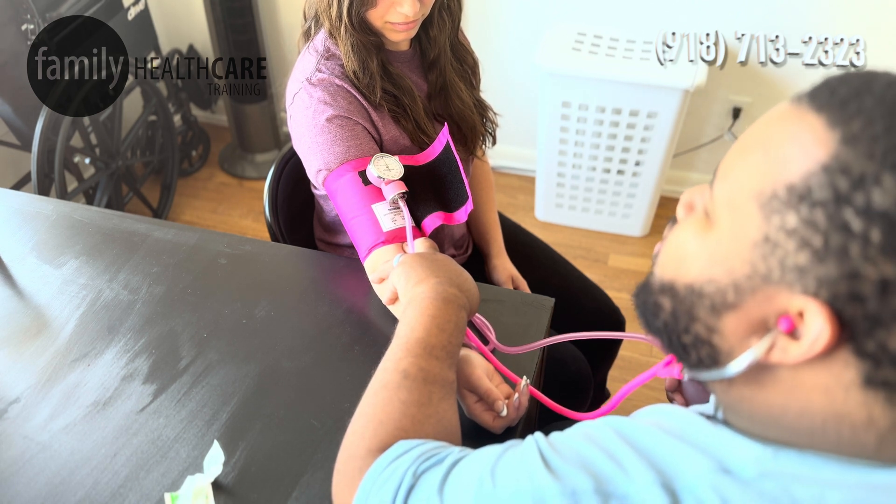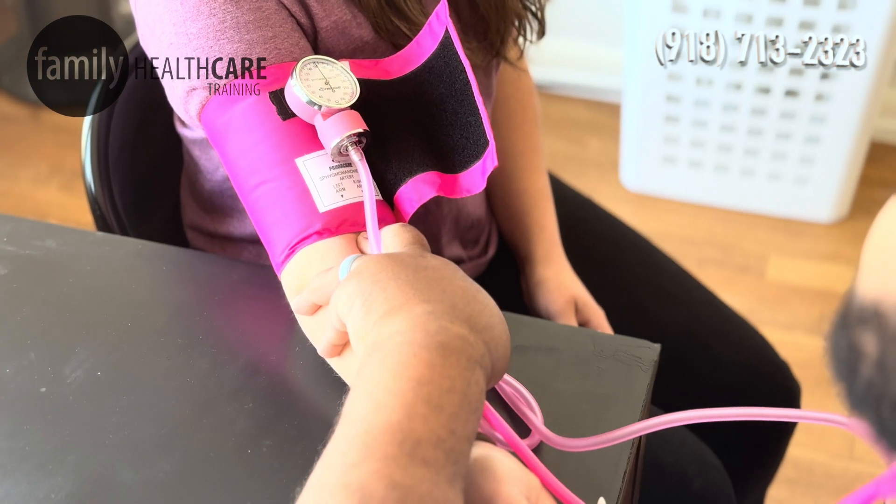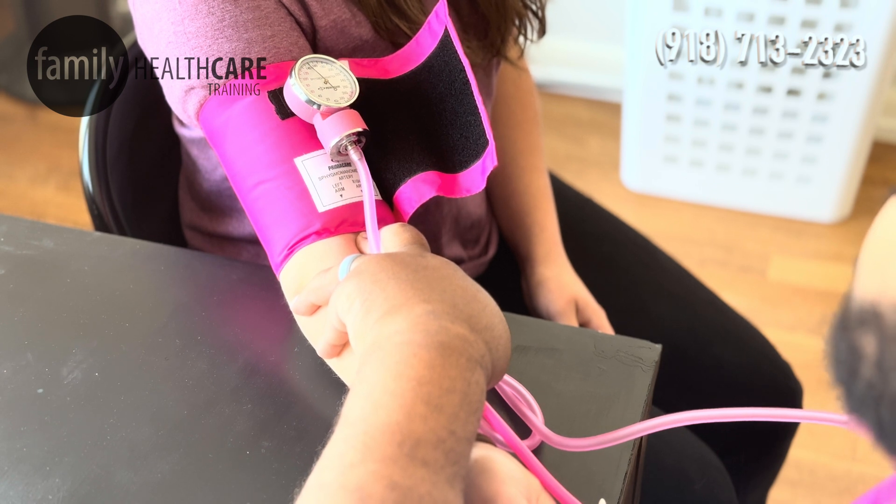Now when we start releasing the air from the blood pressure cuff, we want to make sure we do it nice and slow — like a sweeping hand on a clock.